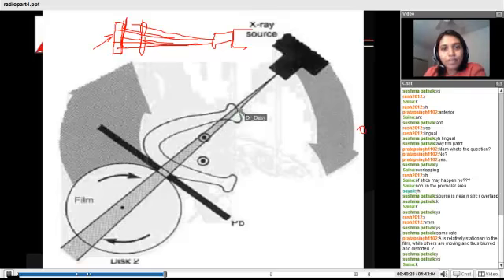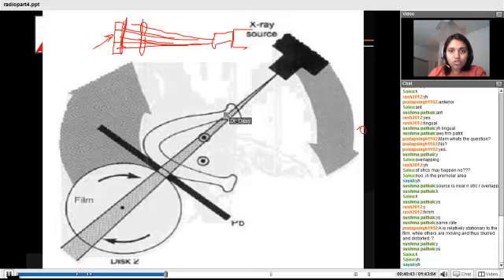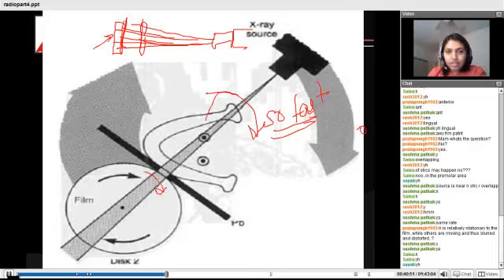So we expect that maybe this also gets recorded and this also gets recorded, isn't it? But because of the center of rotation, this X-ray beam sweeps through this part so fast, relative to how it is moving on the film, that the image of this particular zone through which the X-ray is passing gets blurred.